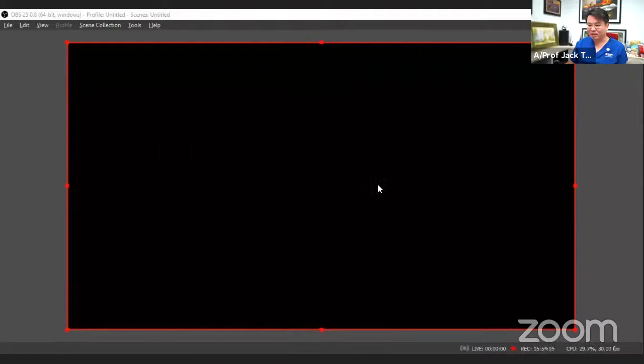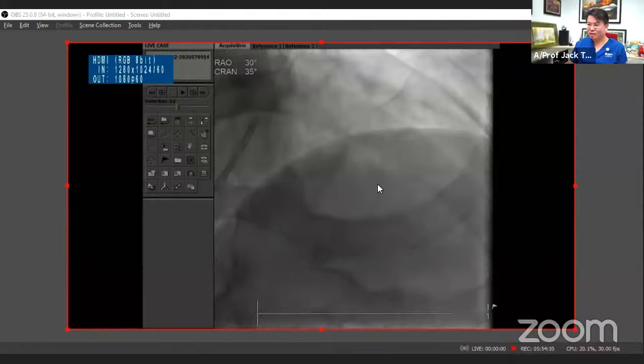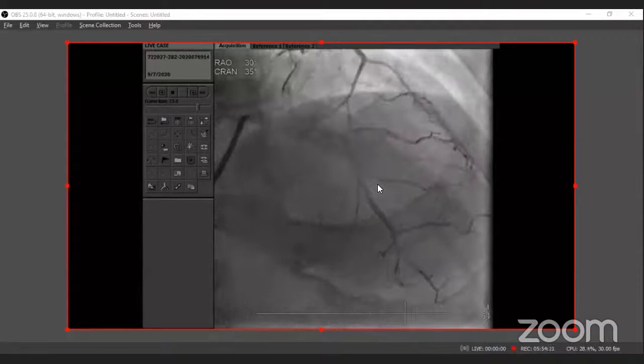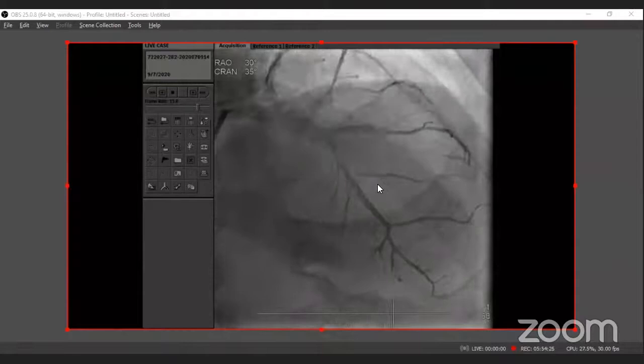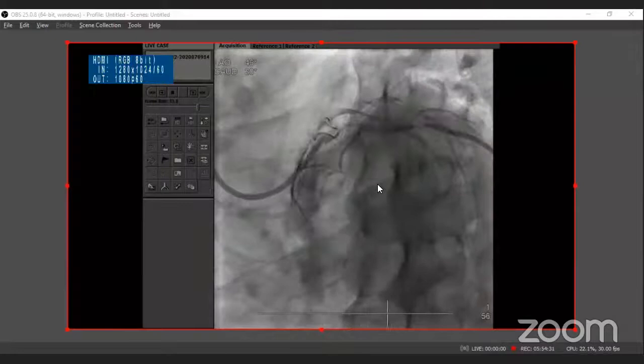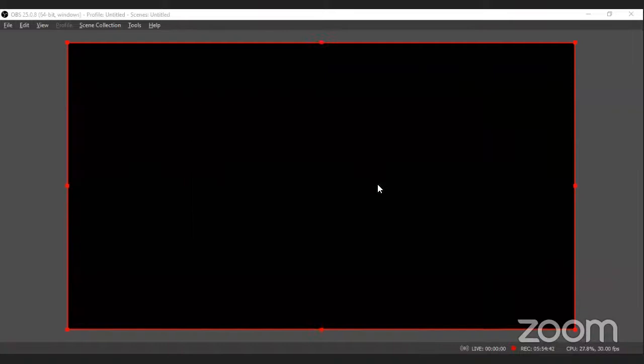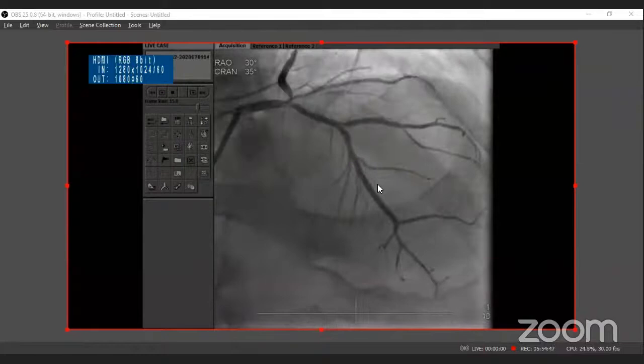Okay, so maybe you'd like to share with us what you've done so far and your strategy for this case and why. Okay, so this is the angiogram that you've seen. The question is whether the LAD lesion is tight, but if it is, it's a borderline lesion in the ostial LAD, but if we want to stent the circ, I think the LAD ostium will probably get compromised. So even if it's moderate, we already decided that we're going to do a two-stent technique. So obviously we're going to do a Culotte in this session. The choice between Culotte and DK crush depends a lot on what Rosalie mentioned, the size of the vessels and also the angle of these two branches.